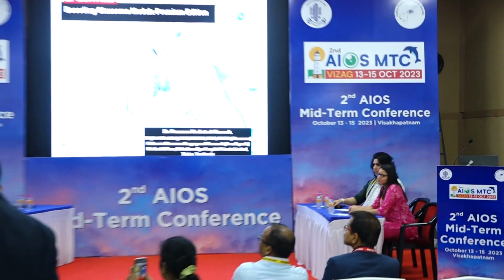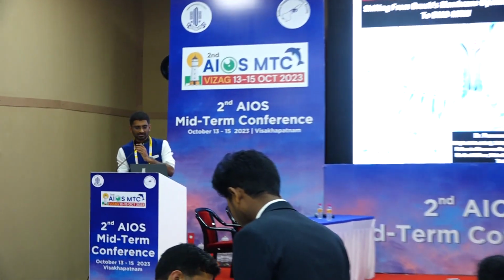So this is Glaucoma Module Premium Edition from Spectralis. I have no financial disclosure, but this is about shifting from the Bruch's membrane opening horizontal rim width that we traditionally used to do in our OCT to shifting to BMO-MRW, that is minimum rim width. Let us start with an animation here.